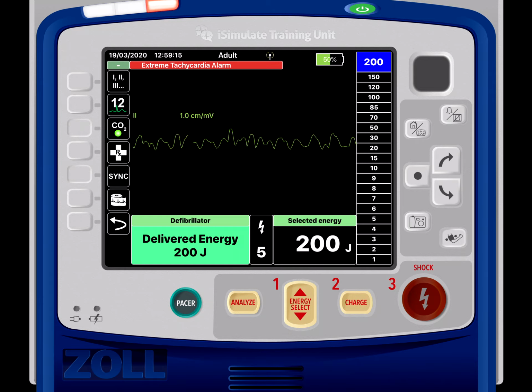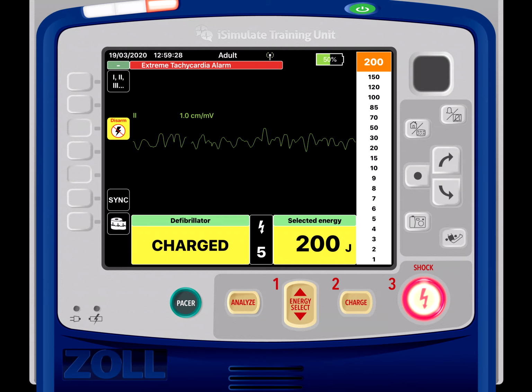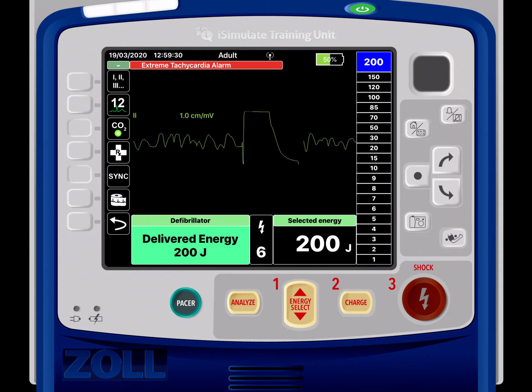The preceptor will tell you that 2 minutes is up. We want to clear the patient, check for a rhythm. VFib persists, so we want to charge again. Clear the patient, defibrillate, back on compressions. Okay, so we're going to do compressions for another 2 minutes. Disregard the fact that the rhythm changed. Don't get sucked into wanting to check for a pulse and things. We're going to defibrillate and do 2 minutes of CPR immediately.